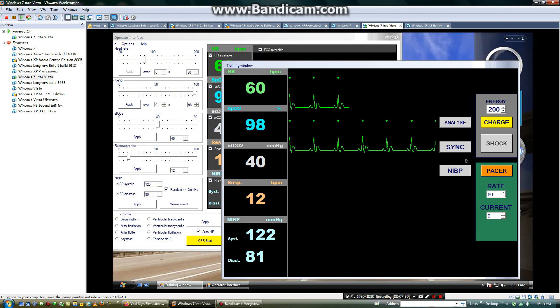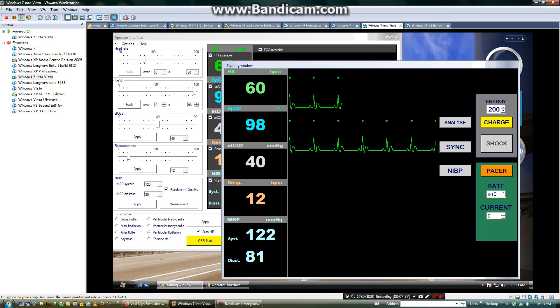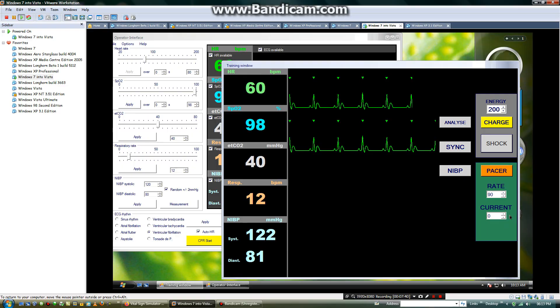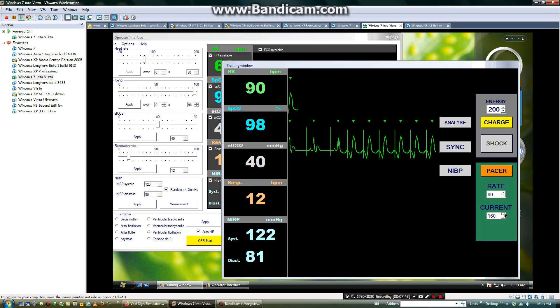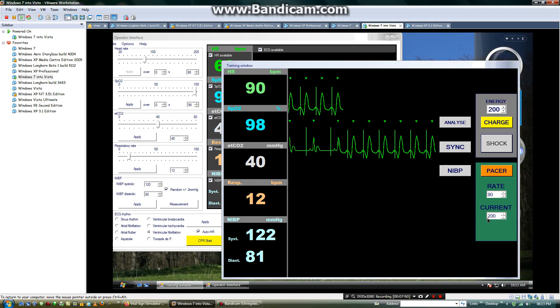Then you will adjust the rate of the EKG. Maximum is 90. Then it will adjust to 90. Then the current, it will be maximum, it will be maximum 200.